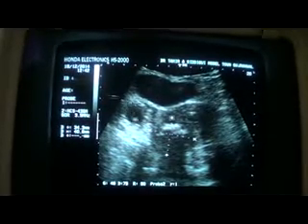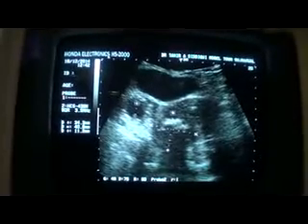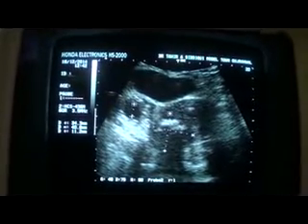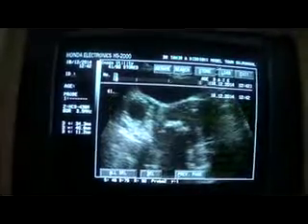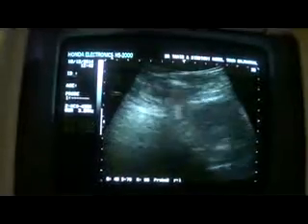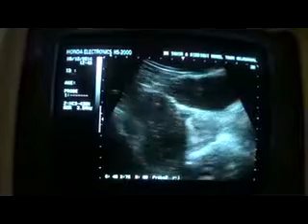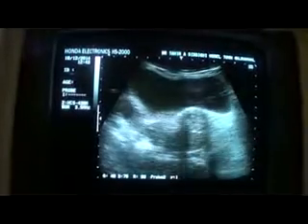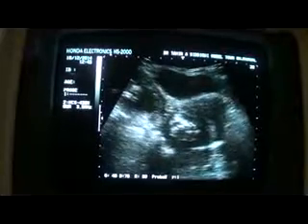Ovary in which we can see a follicle developing, measuring 11.2. Now this is the follicle in fact. So the left ovary is normal, otherwise the endometrial canal is normal. The cervix is okay, and in transverse section we see a solid echogenic area.